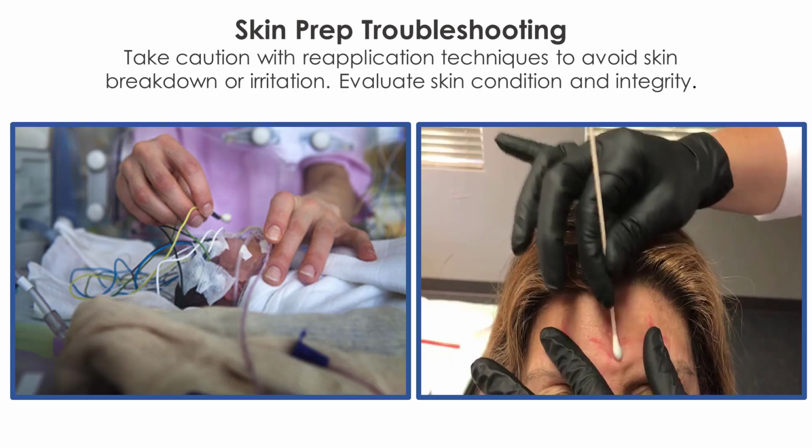If your facility allows, you can use an alcohol wipe to remove conductive paste before you rescrub and replace the cotton tip applicators. This avoids spreading paste and also creates a non-greasy surface to rescrub.